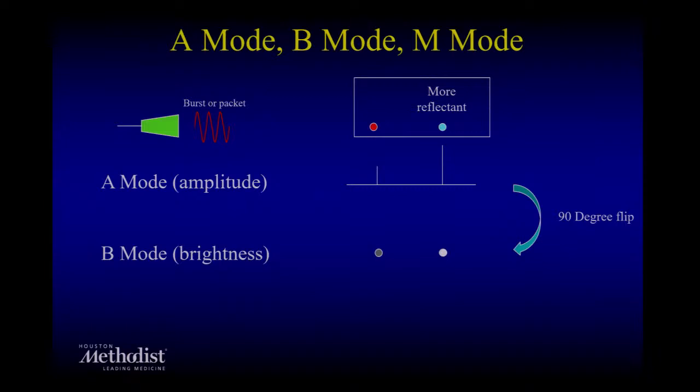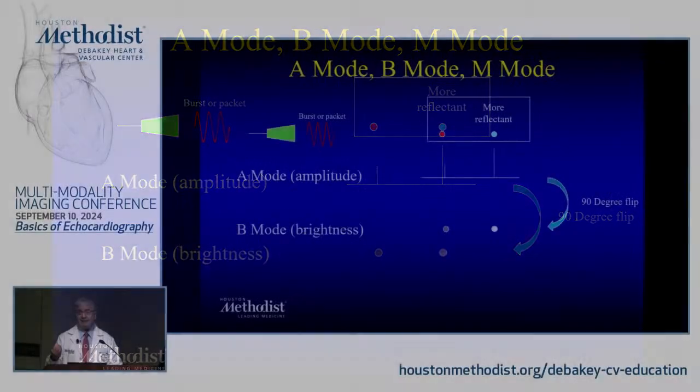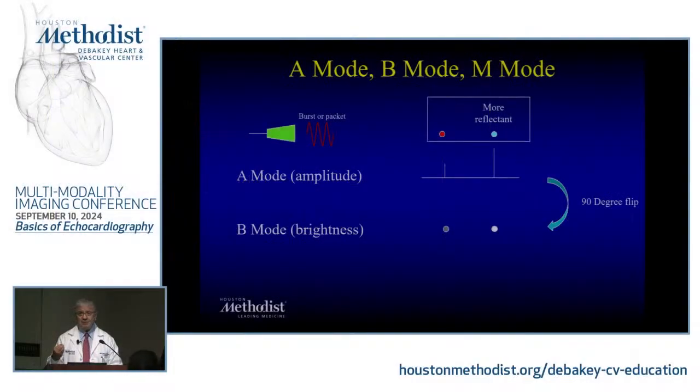Take two things: one, a myocardium, and two, a piece of calcium, just like mitral annular calcification. You know where the depth is, which is the time it took to be reflected back. The intensity is different: calcium is much more reflectant, so the refracted portion that keeps going is much less, and the reflected portion is much more. So I see it much brighter.